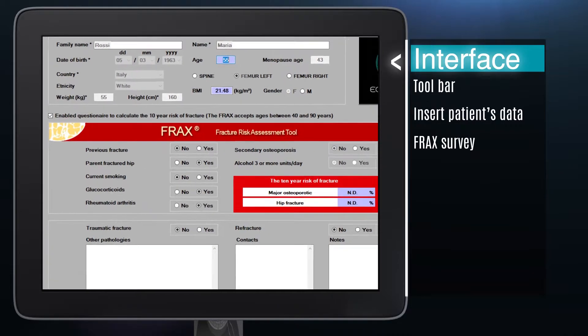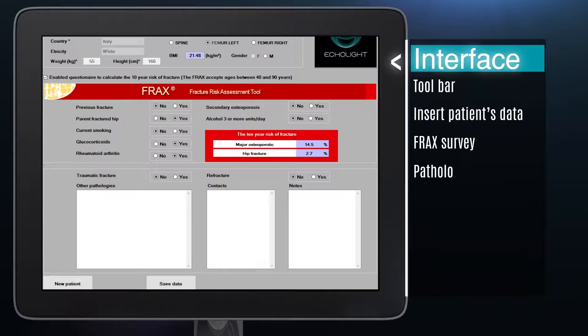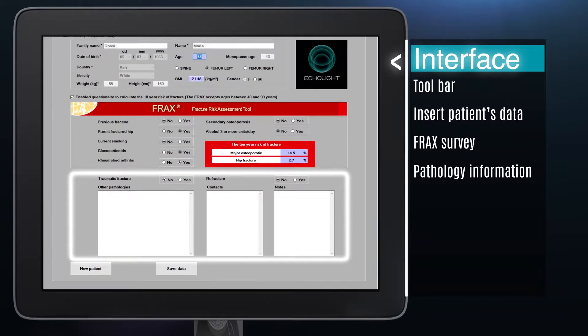The FRAX form for patients aged between 40 and 90 years is in the middle section. The bottom section can be used to insert the patient's history, pathologies, contacts and other information.